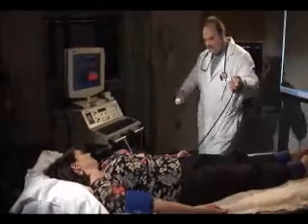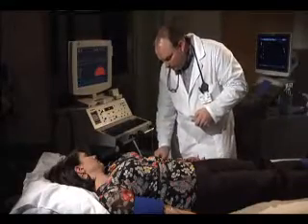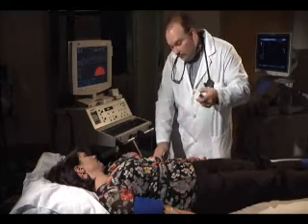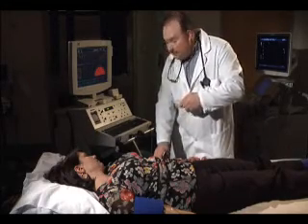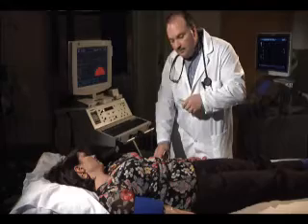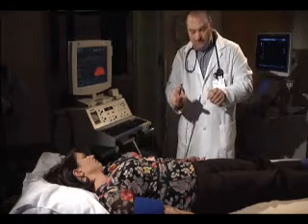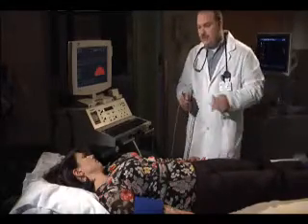The sound that you hear is nothing more than the computer's version of the blood moving through that artery. Now with the blood pressure difference, if water is traveling through a stream and the stream may be eight feet wide, and the stream narrows down to a point where it's only four feet wide, the same amount of water has to go through. So two things happen: the speed of the water increases, but the pressure of the water decreases. The same thing happens in the arteries — if there's a blockage, the blood flow has to move faster through that section of blocked artery, and everything beyond that drops in pressure. And that's where we look for the difference in the blood pressures in the ankles.